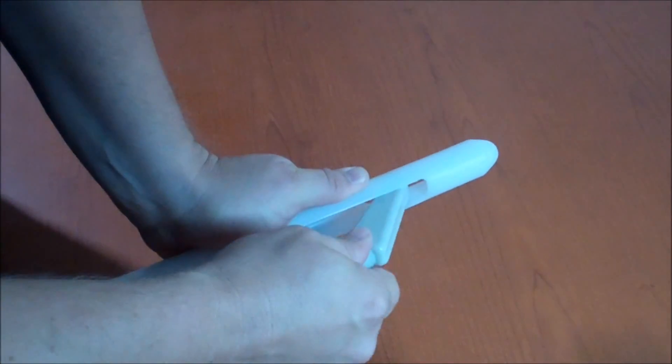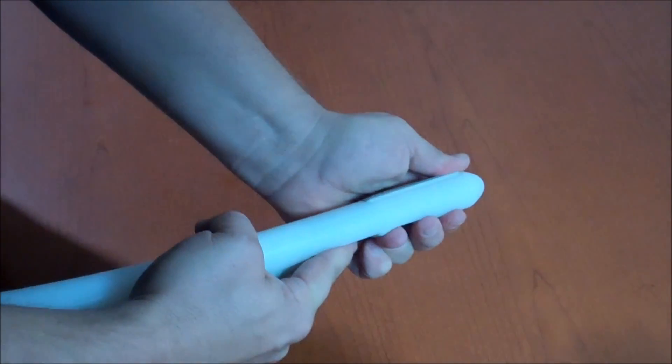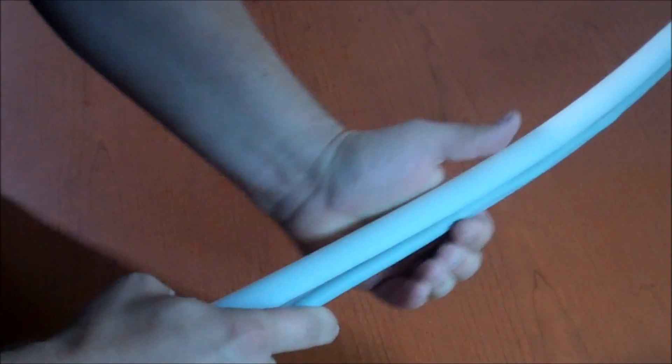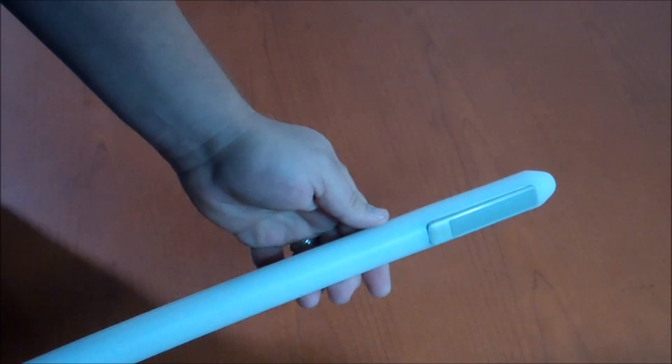First, you want to insert the probe into the top face of the introducer. It will snap into place. Run the cord down the handle, like so. And you're ready to go scan.